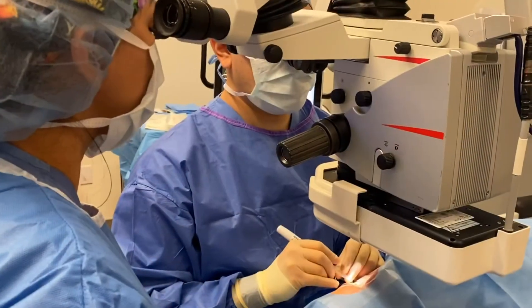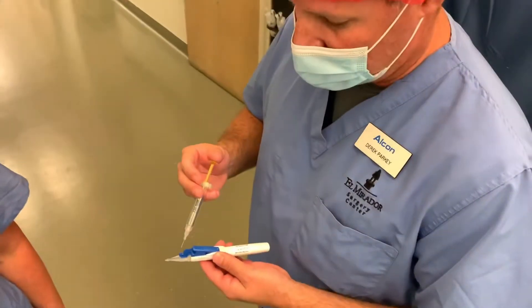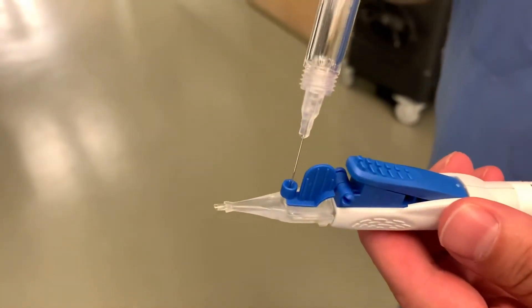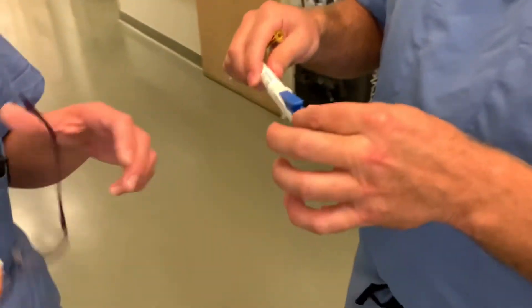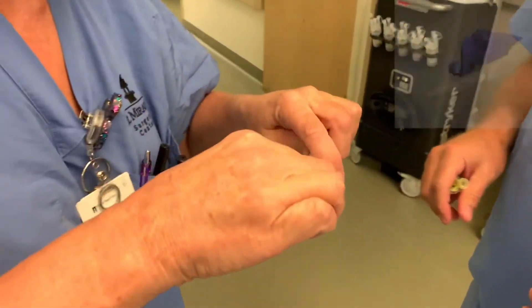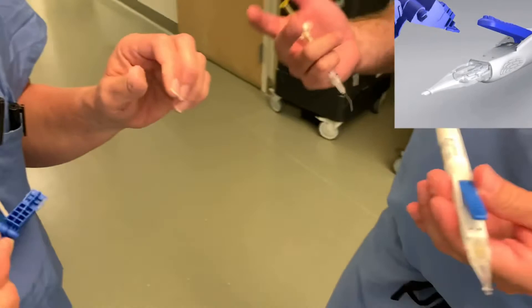Let's listen to Derek talk about the setup of the cartridge for use in surgery. You're going to fill with viscoelastic all the way till the very end, and the viscoelastic is going to stop at this little stopper right here. Then pull on this as hard as you can — you're not going to break it. And then your setup is done; you've prepared the device.